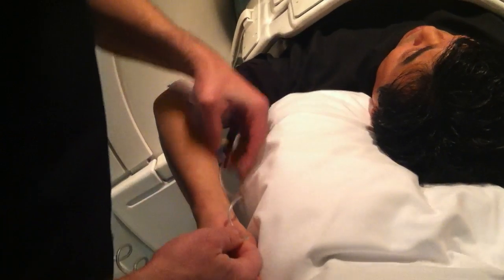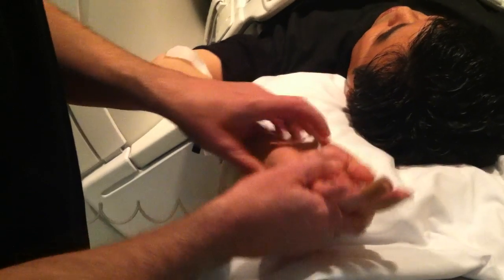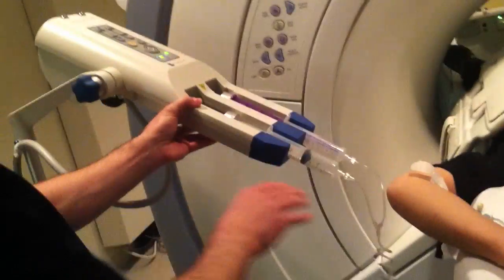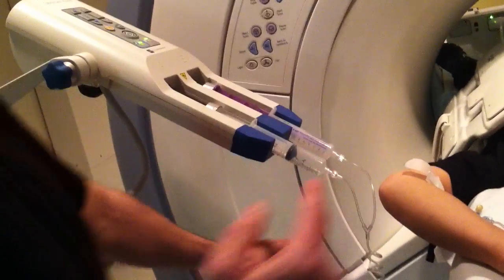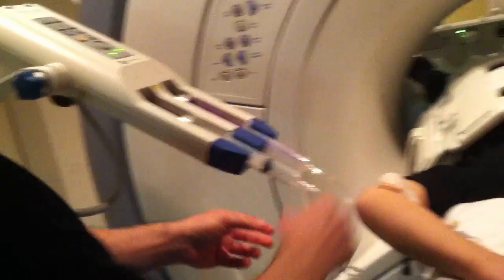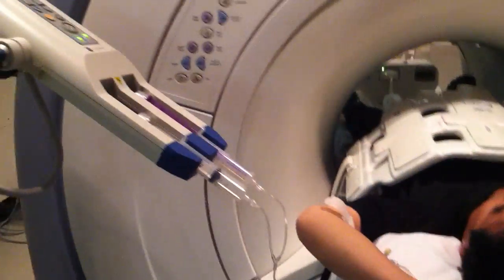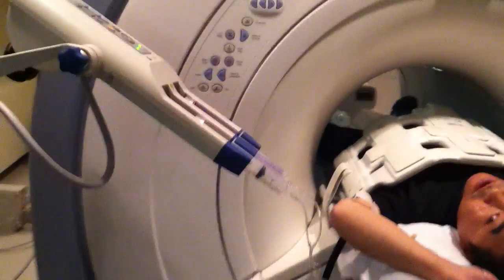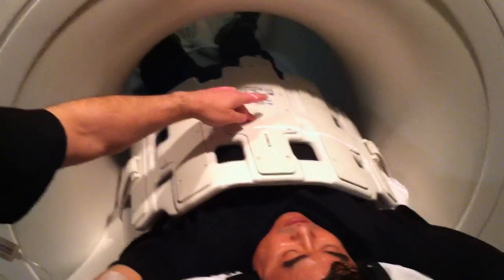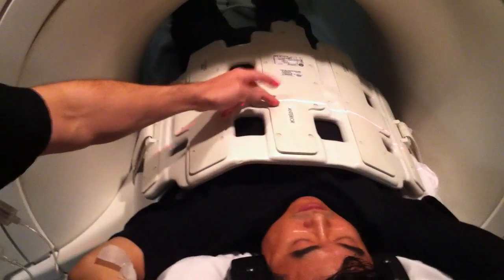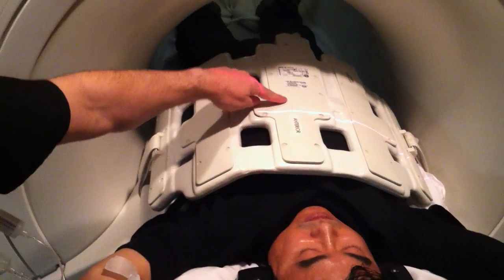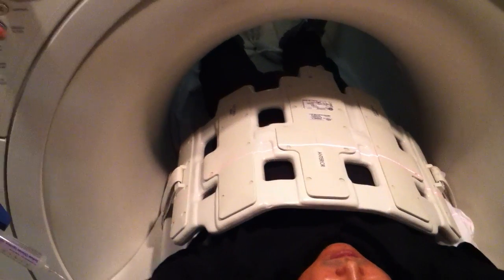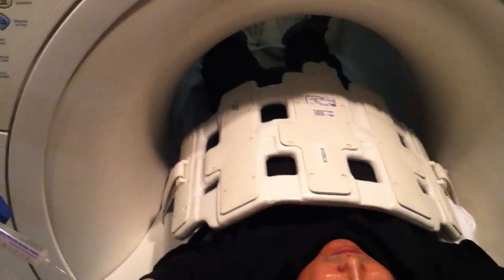One thing you can do is feed it through his hand. And this way it doesn't pull out if there's any tension on the line. You can take your power injector and aim it like this because he's going to go in the magnet. You want enough slack here to be able to feed it in. We're going to landmark at the liver. The coil is not going to be centered over the liver, so we want the landmark at the liver, which is above the center of the coil, and send him on his way.